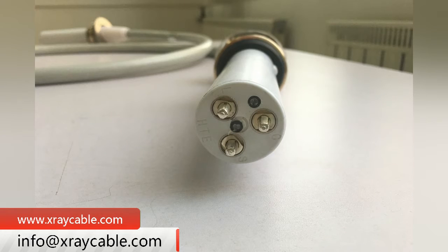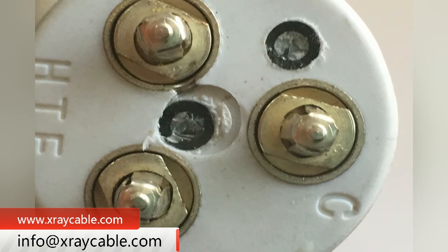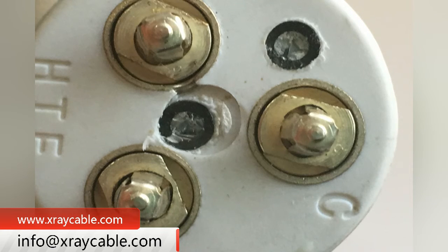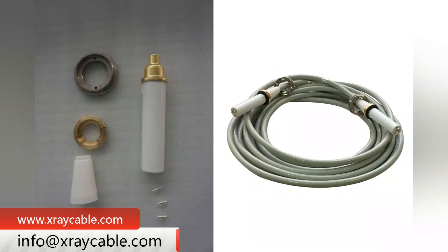General customers selecting high voltage cables should not exceed 20 meters in length. When using high voltage cables, attention should be paid to protecting them. They should not be bent to a large extent to avoid damage, and should not be placed in high temperature areas to prevent melting or deformation of the rubber sheath of the high voltage cables.